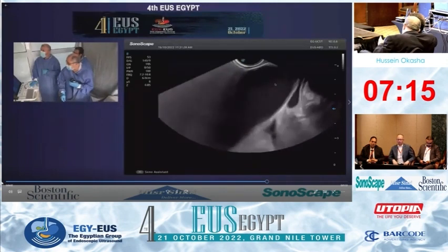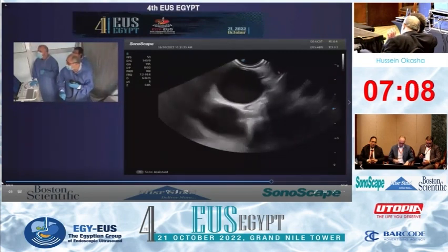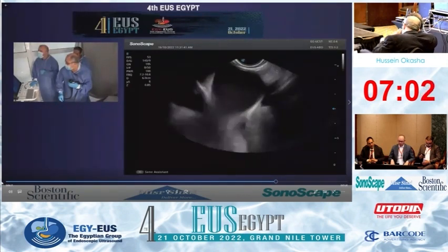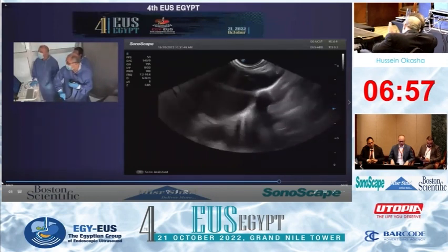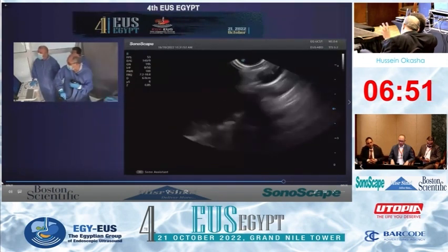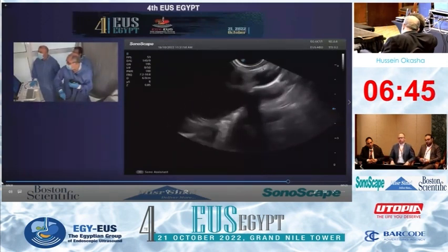I'll keep withdrawing the echo endoscope, and this is the aortic arch very nicely. And I keep withdrawing, and I can see the first and largest branch of the aortic arch, which is the left subclavian artery. Yes, very nicely seen. It is a big branch, and here the left subclavian artery is arching, ends here and arching down. Okay, here I can see station 2L, 2 left.